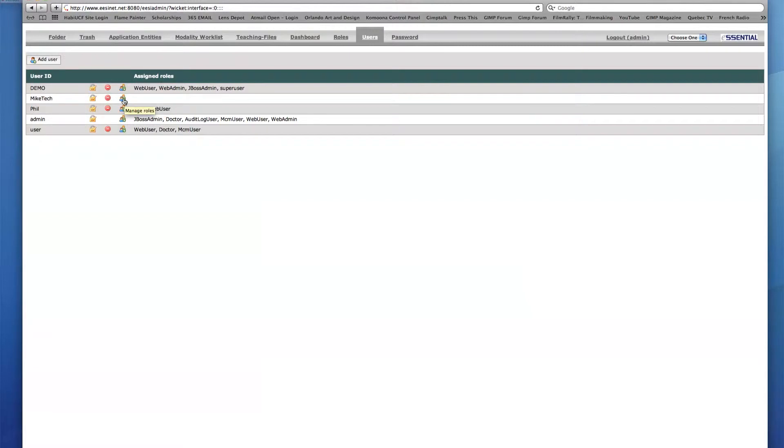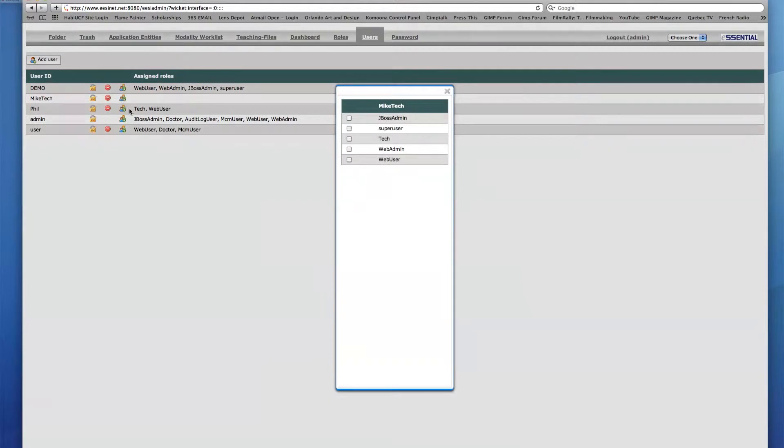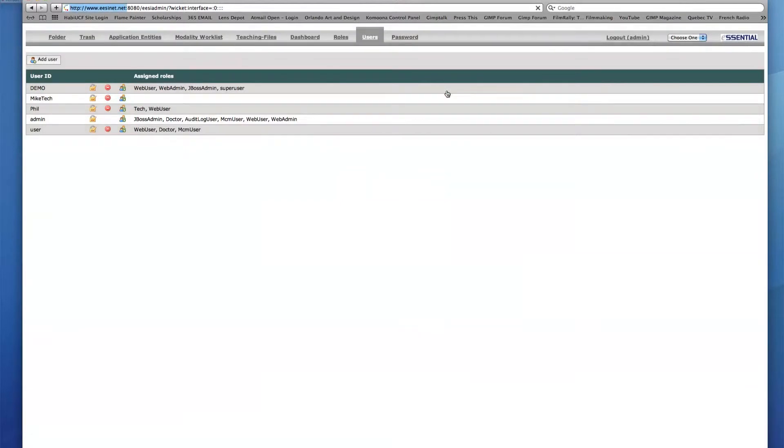I want to make Mike Tech a web user so that he can log into the PACS and perform basic tasks such as Search for Patients in the Folder tab. I will click the Manage Roles icon and check Web User. I also want Mike Tech to have the capabilities of a technician, so I'll check the Tech box, then Exit. The two new roles now appear under the Assigned Roles area in the Mike Tech row.